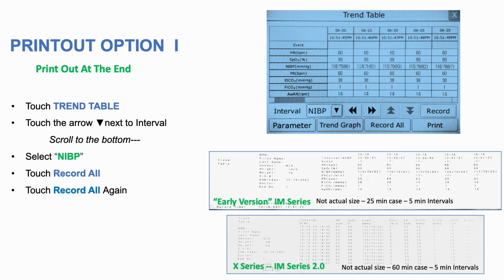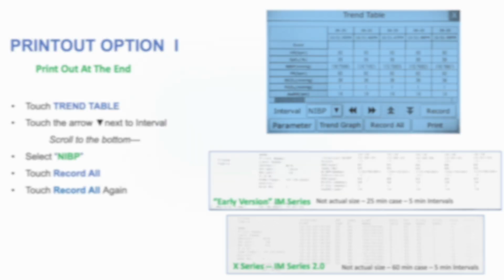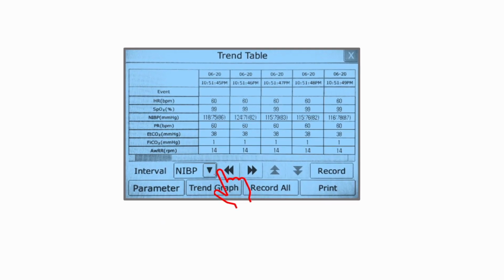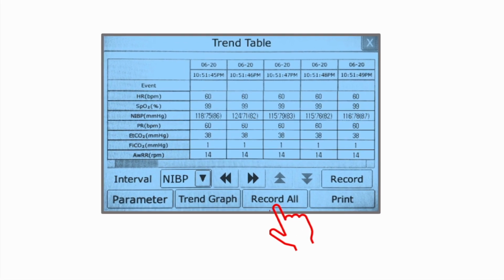Press the Trend button or touch Trend Table on the shortcut menu. Touch the arrow to the right of interval and scroll to the bottom. Select NIBP, touch Record All again.